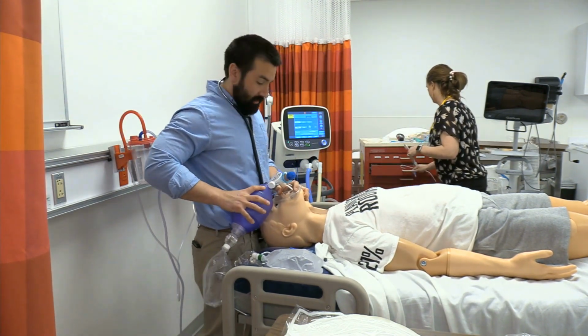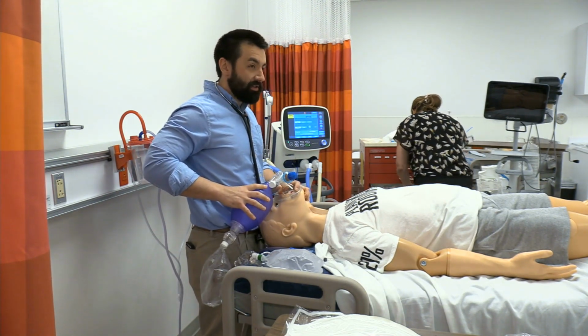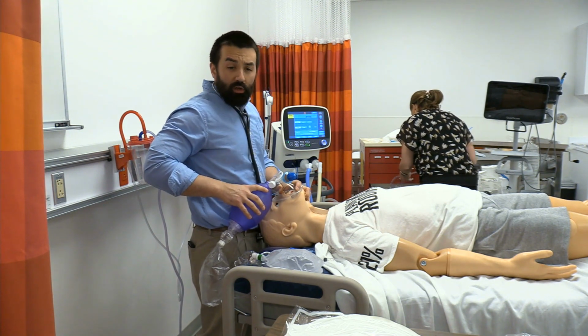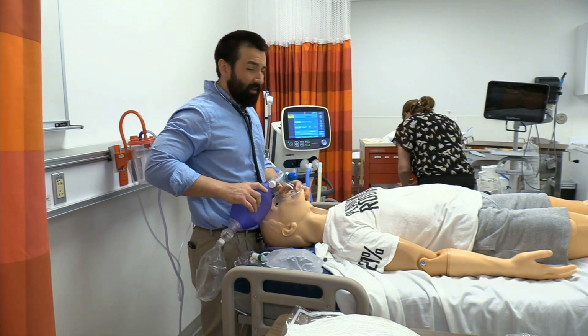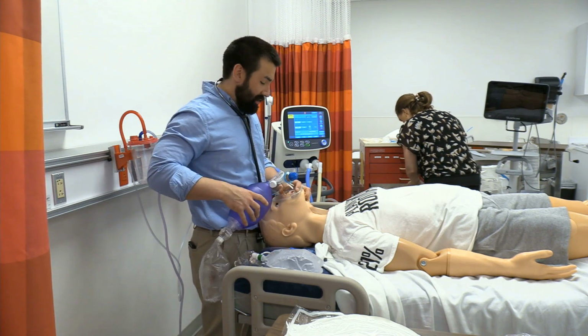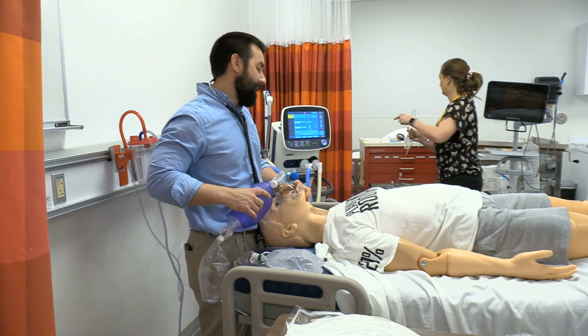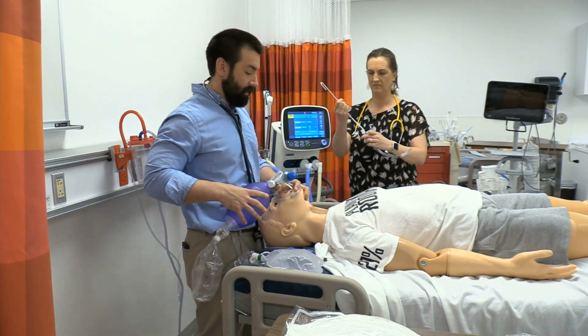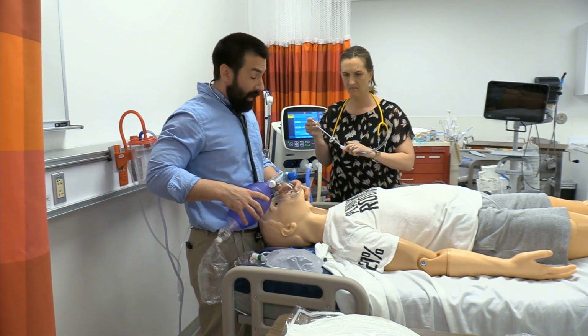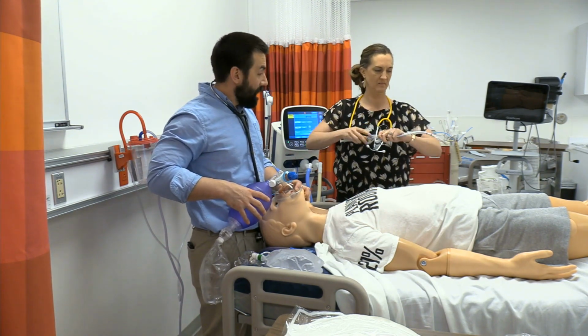So I'm going to get a nice seal and provide some manual ventilation here, about a breath every 6 seconds or so. You don't want to grab that same tube and put it in the trachea, since it's just been in the esophagus. A lot of times you have a bunch of gastric juices shoot up. Sometimes your CO2 detector gets a little juicy and we'll swap that thing out, but we're just playing with ours anyway, so we're good there. I've got a syringe right over here if you want to go ahead and check that cuff.